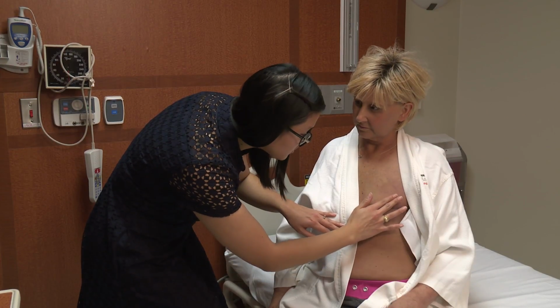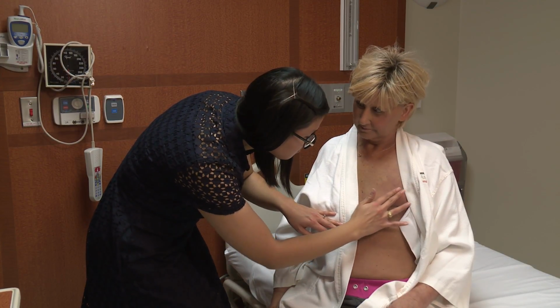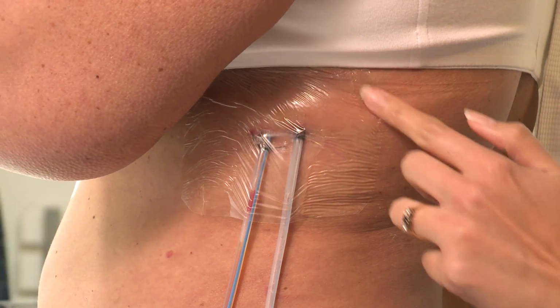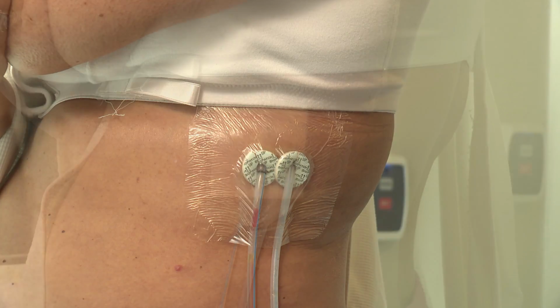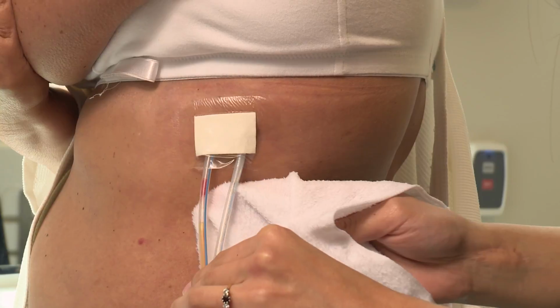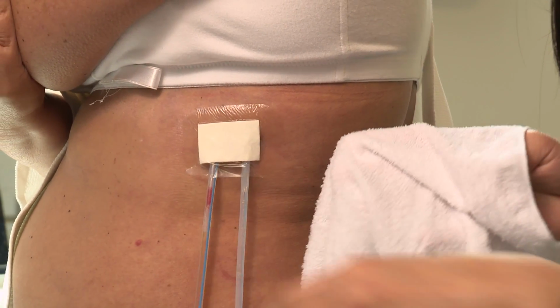Your incision may be closed with stitches that dissolve on their own or stitches that need to be removed by your surgeon at a later time. You may also have a dressing over your drain insertion site. There are many types of dressings used to cover incisions. The type of dressing you have on your incision may be different from what is shown in this video. You will receive separate written instructions on how to care for your incision and dressing.